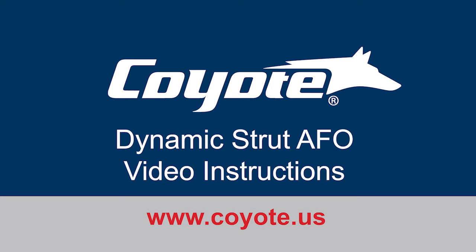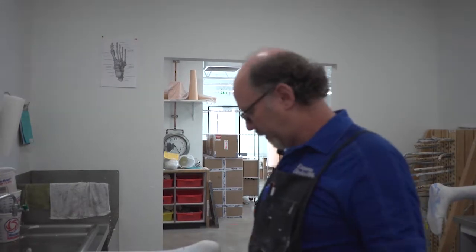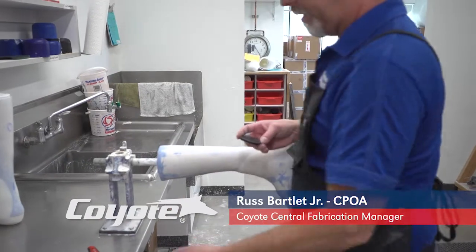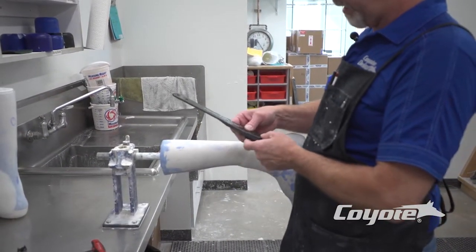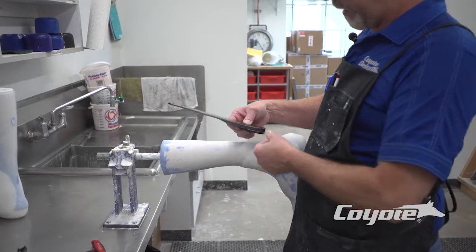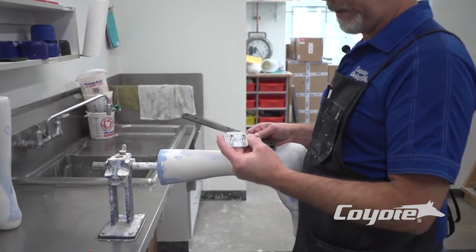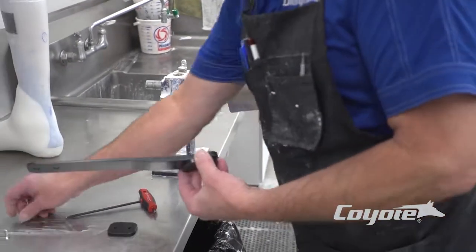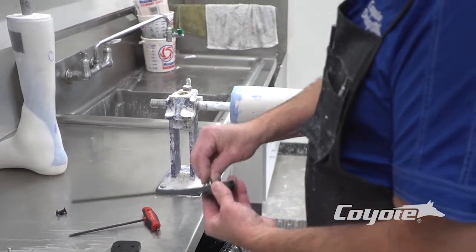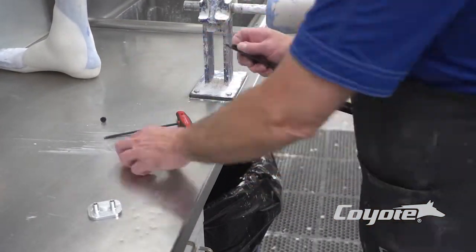This is the new Dynamic Strut 2.0 and we're doing the mounting process with the tooling so we can do the finished product when we pull our plastic. The first thing we need to do is take the tooling pieces and mount them to our strut and then set them up on our cast. These tooling pieces will be the blanks for our finished product when we get our plastic pulled. Let's get these put together first and mount your strut onto your cast.